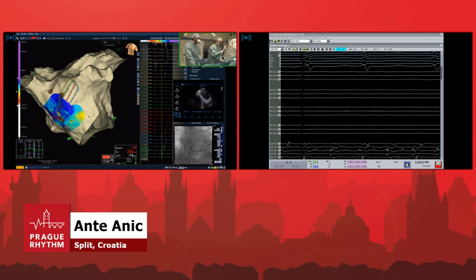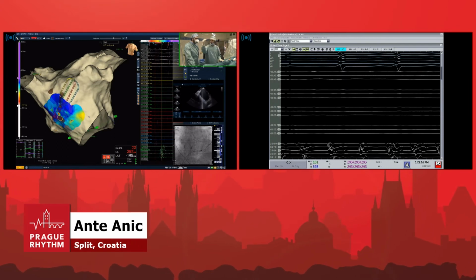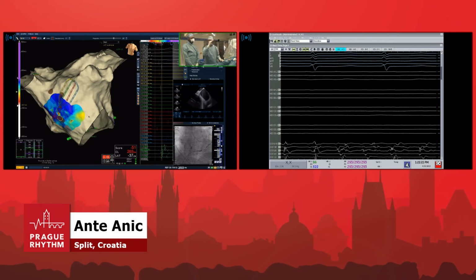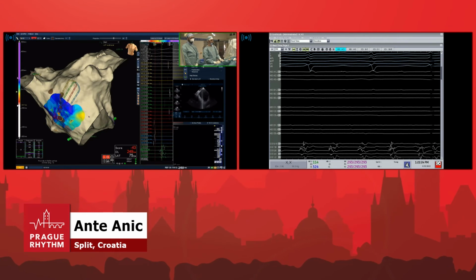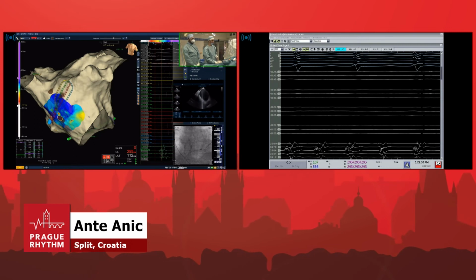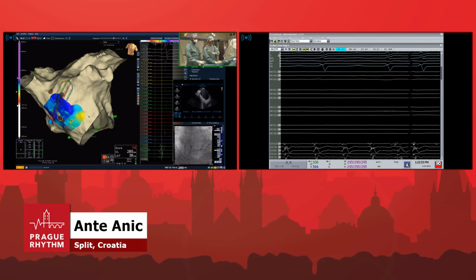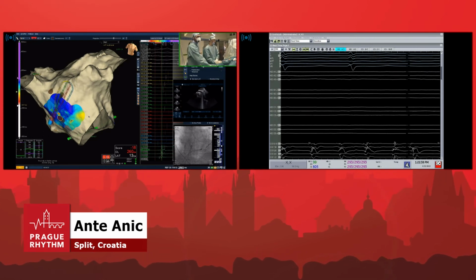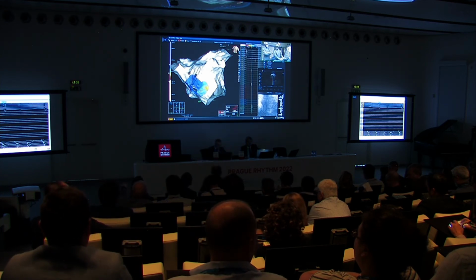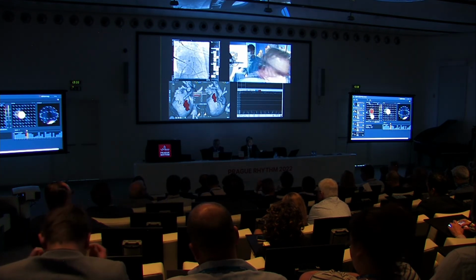No, but we're gonna position it strategically, half of it gonna extend from our scar, so we're gonna gently shave it from the anterior rim of our ablation lesion set and go gently anterior. So it's doable. It's doable with Farapulse. Of course, it's easier to put a few dots with the RF, but maybe we can do it with Farapulse here also. Okay, so I think we will move to Homolka. But we have to finish in a few minutes, maximum about 7 minutes, not to cut time for lunch.